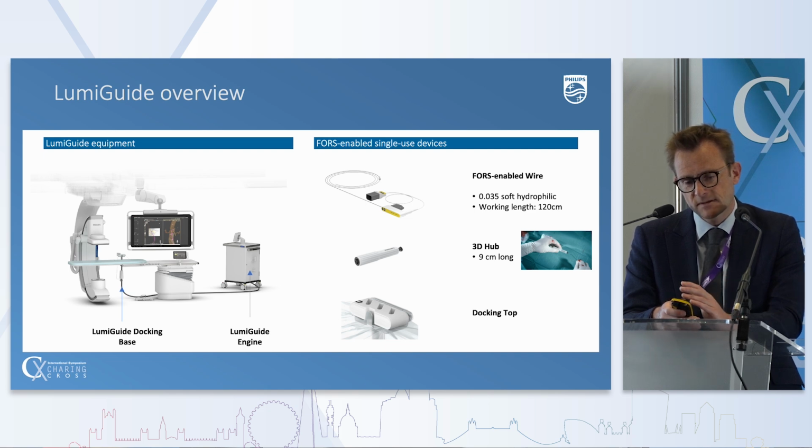Since the catheters at the moment are not tracked, Philips developed a very convenient tool, the 3D Hub, which is able to recognize all the catheters you use in your daily practice.